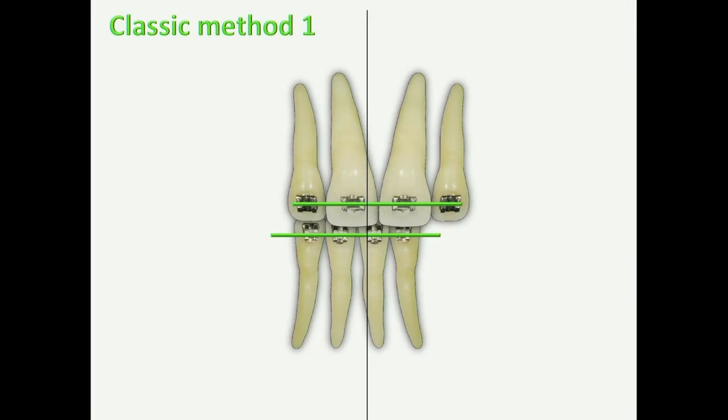One of the most challenging treatments would be correction of midline in the orthodontic field. The most common approach to correct the midline is to take a patient and treat them with the anterior crisscross elastics. However, we would find that our success would be somewhat limited.